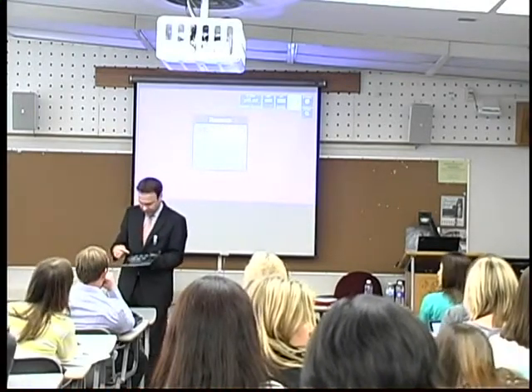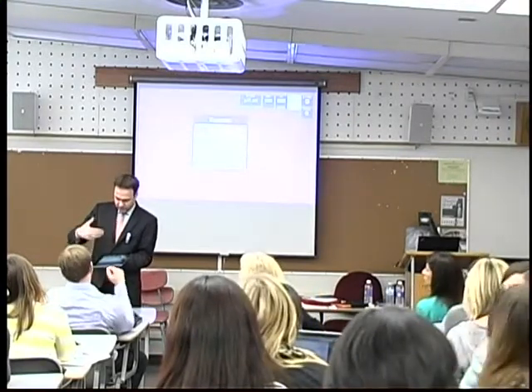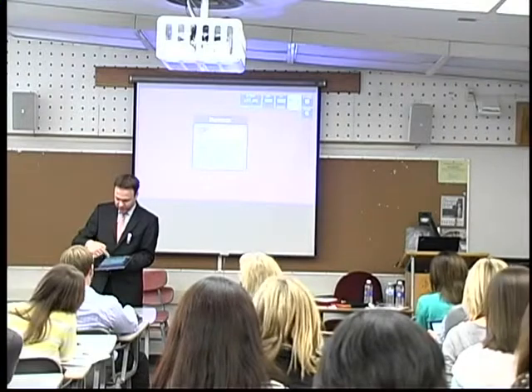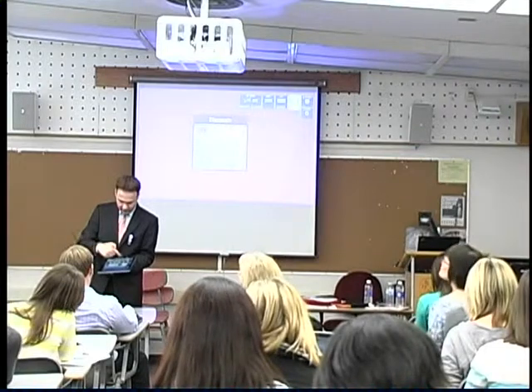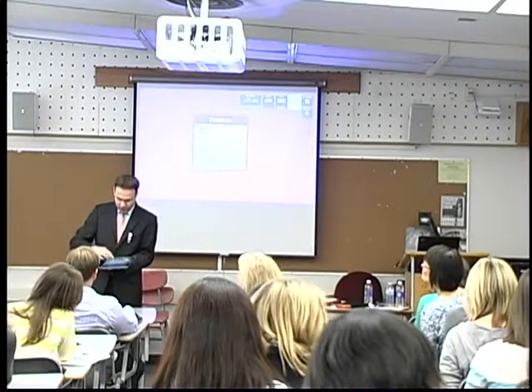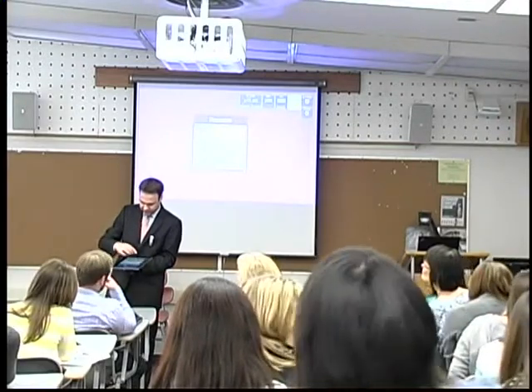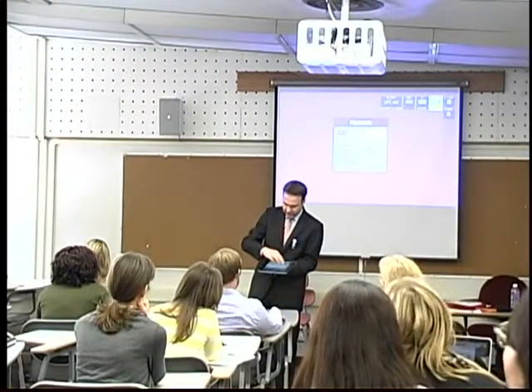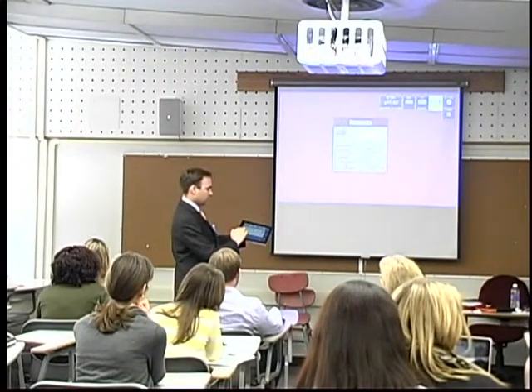This goes back to that question of how the vocabulary is organized. We are setting up so-called activity sheets, and these activity sheets could be foods, they could be basic wants and needs. We can have an activity sheet for colors, we can have an activity sheet for different types of people. And then I can browse through these activity sheets here on the very top portion, and if I have a lot of symbols in one activity sheet, I can also, with a little swipe, go back and forth within a sheet.